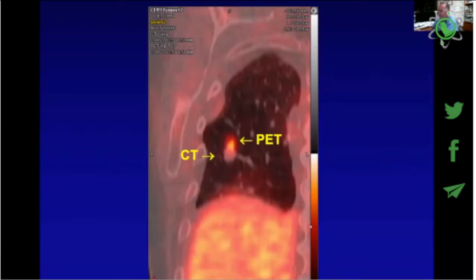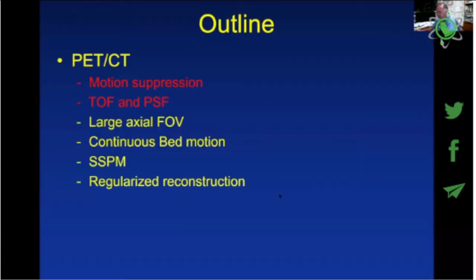described in this regard. However, right now, there are no techniques currently available that match the PET data with the CT data. We can create an average CT, and that is available on different manufacturers, but we cannot acquire a single CT and a PET scan and make sure that the CT data is matched in the same location as the PET data, because the PET, like I said, is acquired over multiple locations. Even if we create a gated PET scan, it will not match the CT data accordingly. And there are no such techniques in this regard.